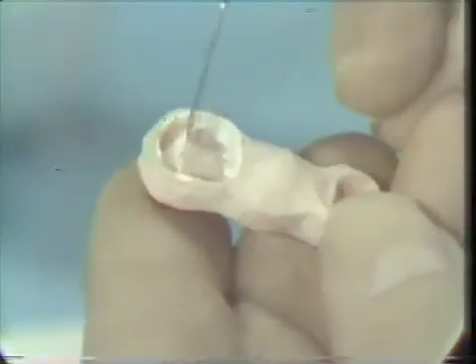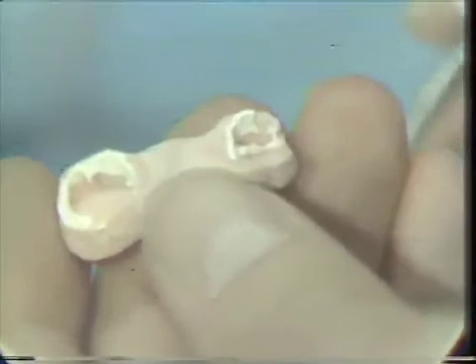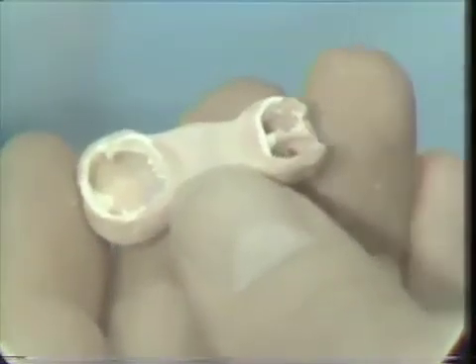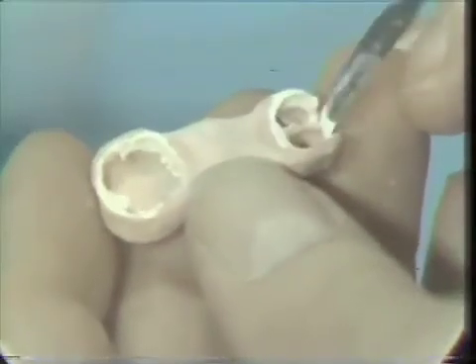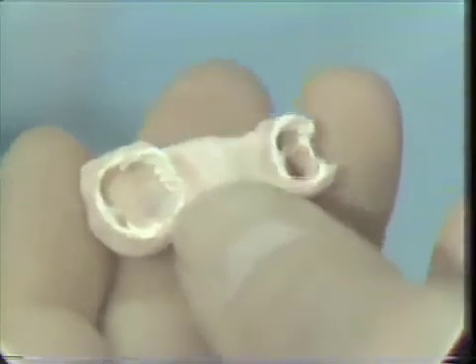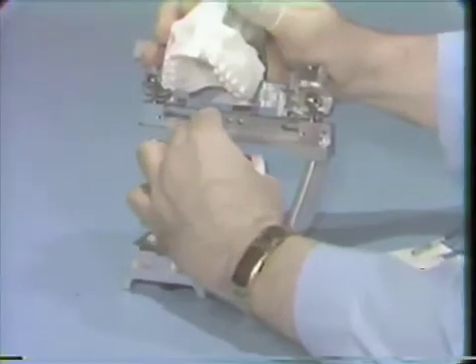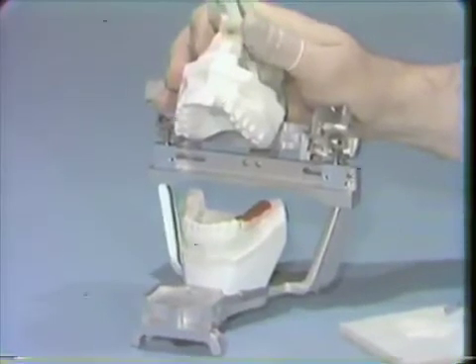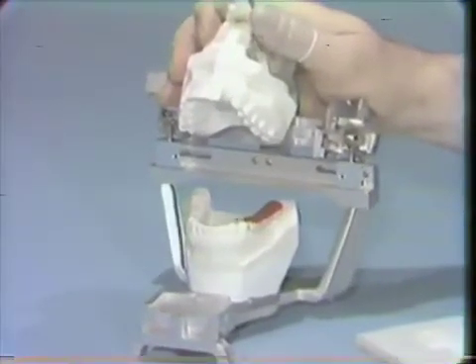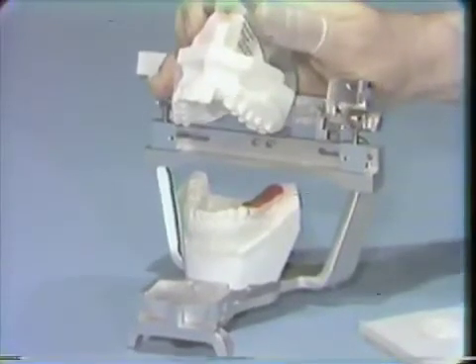Obviously, if we're going to cement this into place, it precludes the indirect technique, which we will subsequently describe, since it would be difficult to remove this platform intact from the mouth. The advantage of the direct technique over the indirect technique is that we've eliminated one potential source of error, and that is the transfer of the platform to the dies for subsequent registration of the stone functionally generated key. We are now ready to do our functionally generated registration.